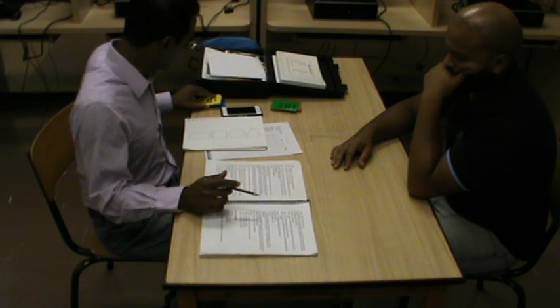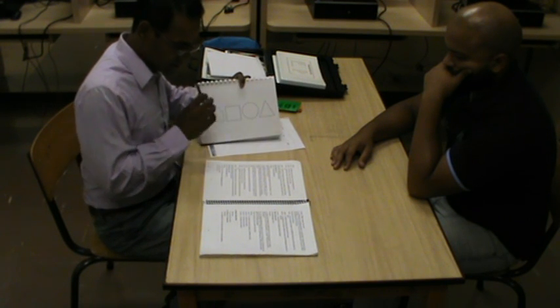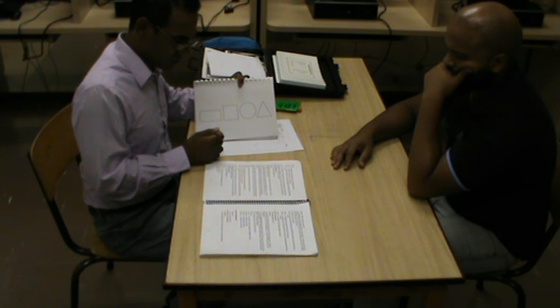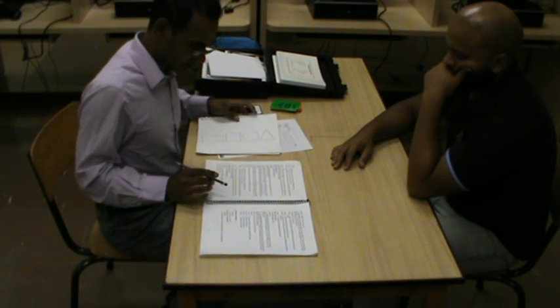And if he has the same problem as before, expressive or receptive aphasia, you follow the same process by using this board, and he needs to identify the shapes on the board. So for example, the manual says, if the client is unable to name the shapes because of expressive problems, the examiner asks the client to point to the target shape on the boards in the test booklet. The examiner says, show me the circle. If the client has receptive problems and is unable to identify the shapes by understanding, the examiner shows him the cards of similar shapes and asks him to point to the similar shape on the board by exact matching.